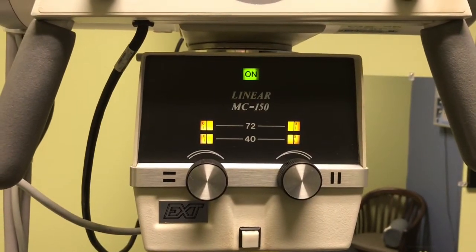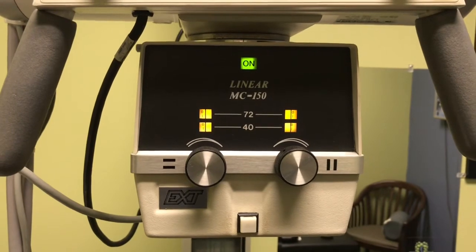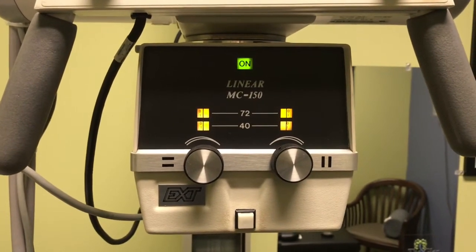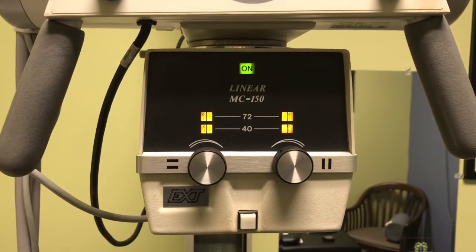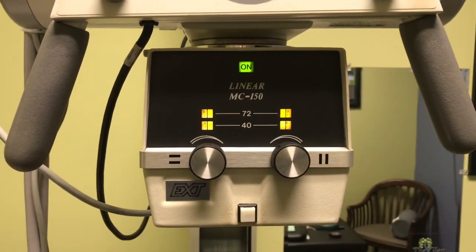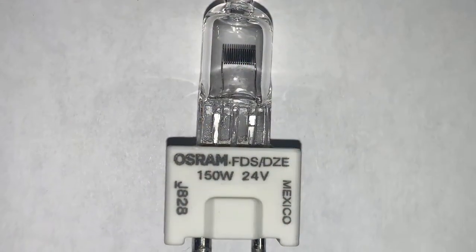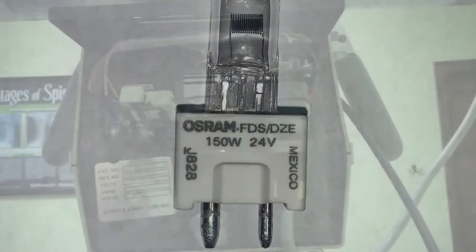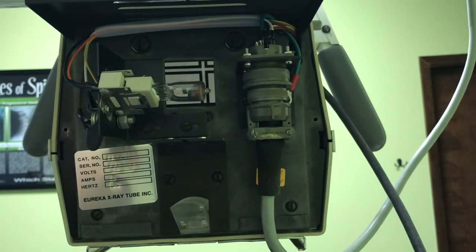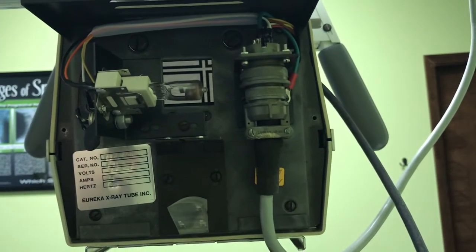This is a Lineair MC-150 collimator. It uses a DZE 150 watt 24 volt bulb. Here you can see the collimator with the back removed and you can see the bulb is accessible.